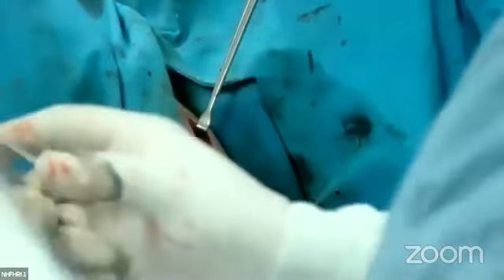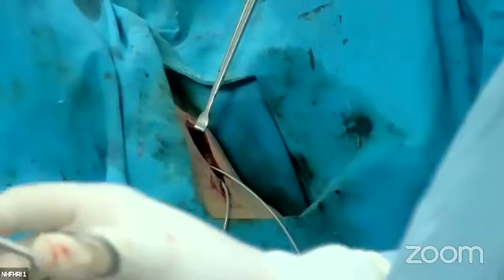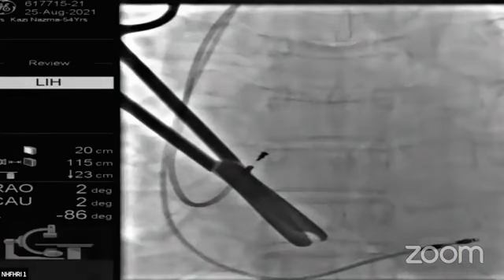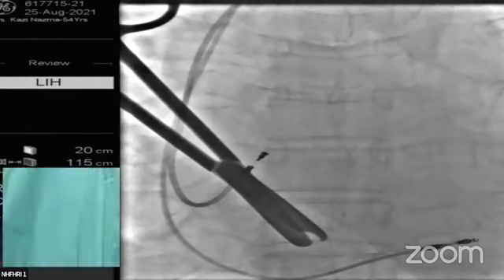Because you have got an X-ray machine here, just go to the left apex. There will be loss of lung shadow in the left apex first, at the puncture site.